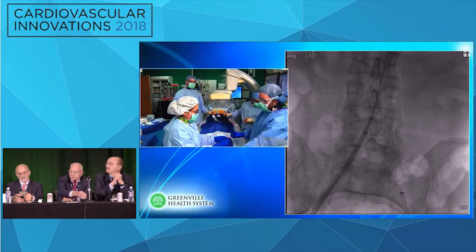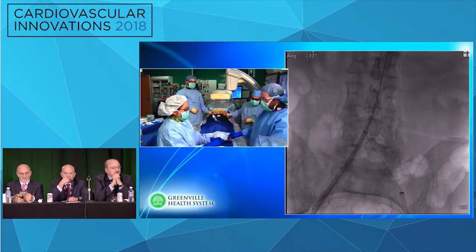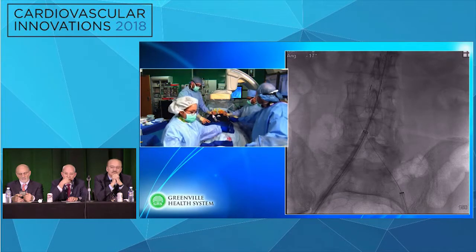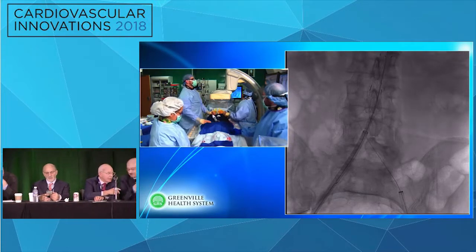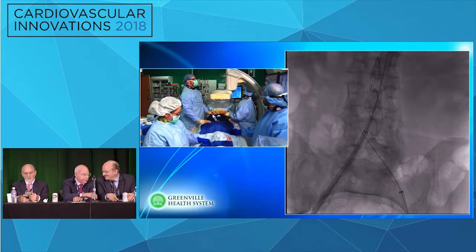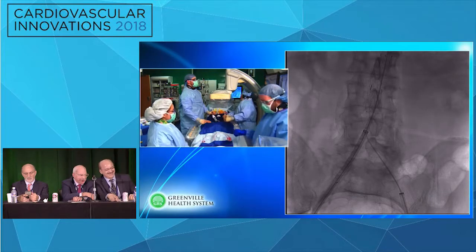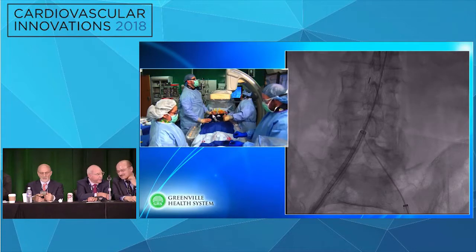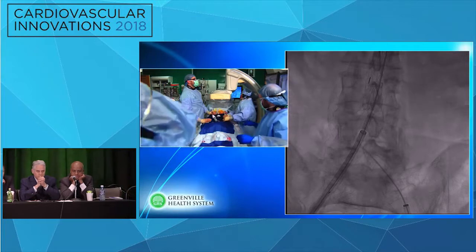Carlos, I want to get you into this discussion. Any preference of various devices that you would use, something that you have personally as your favorite? No, I think that as everybody has said before, any of those devices. This is a perfect AAA, good landing zone, neck is good. I agree with Peter's comment about the tightness of the iliac bifurcation. The comment about the IVUS, I do think that routine IVUS is of utility. I don't know that it's that particularly expensive, and you'll be surprised in some of the cases. In terms of the closure device, I appreciate the use of pre-close in a case like this.